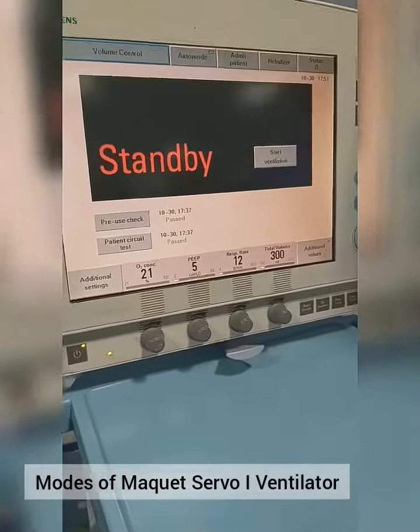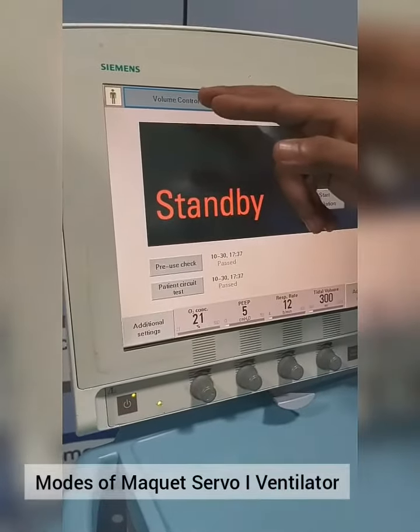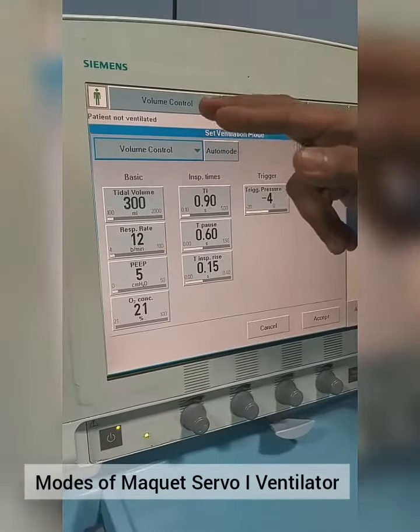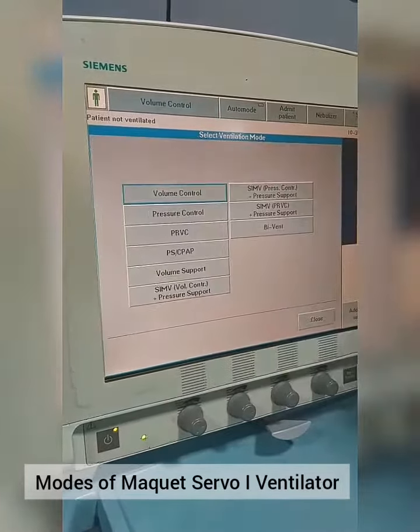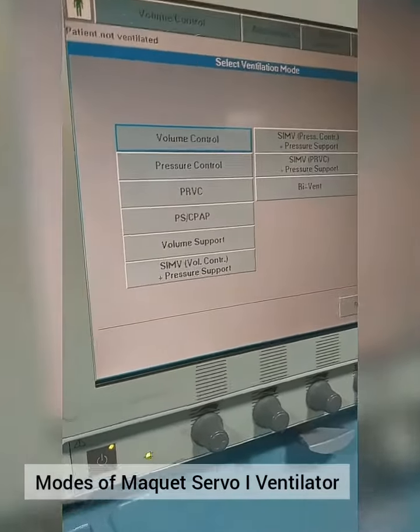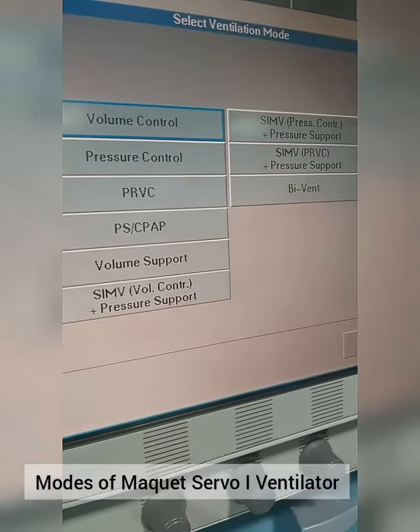Hello, here we will see the Modes of the Maquet Servo I Ventilator. We can select Modes from here. These are the Modes of Ventilation.